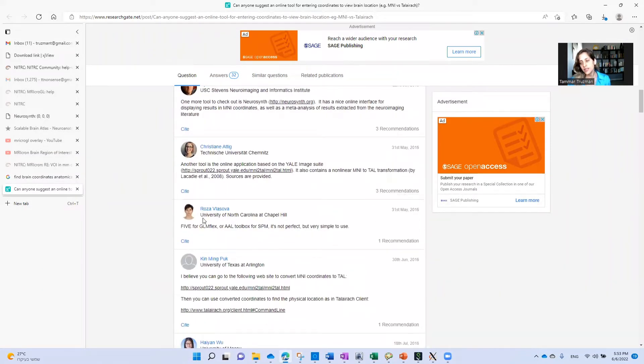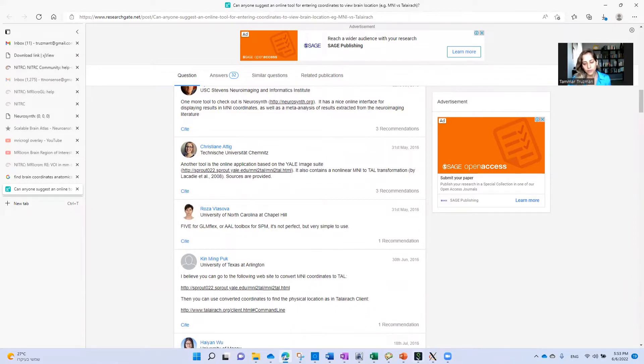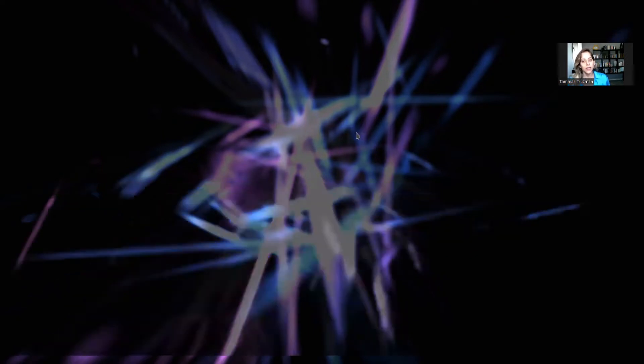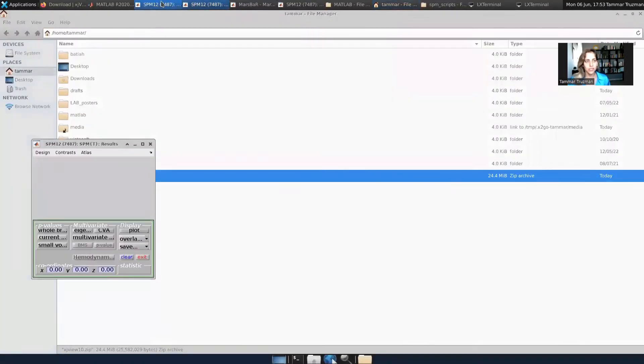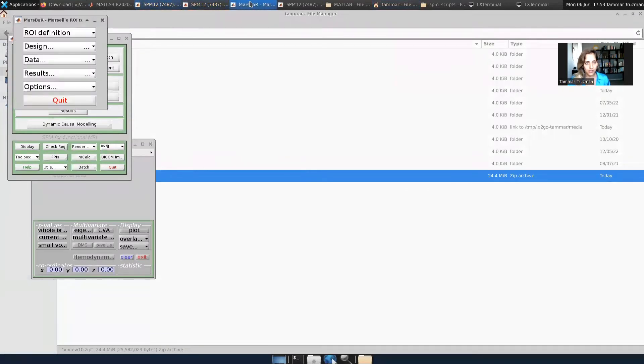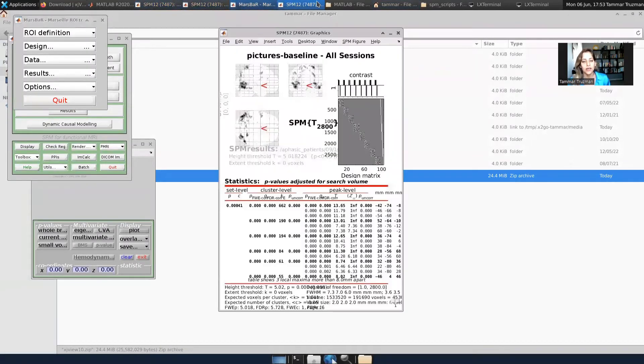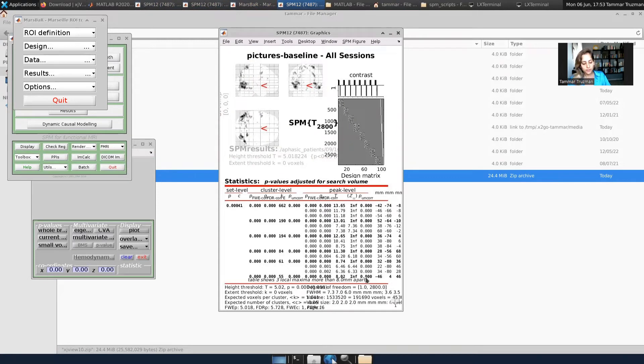Now I use SPM 12, and when I use it, for example after first and second level analysis, I get a list of brain coordinates that were activated during the task, and I want to convert them to anatomical regions.